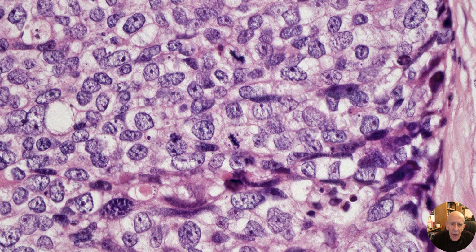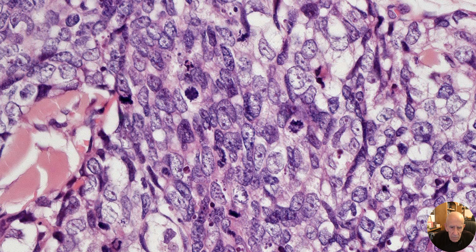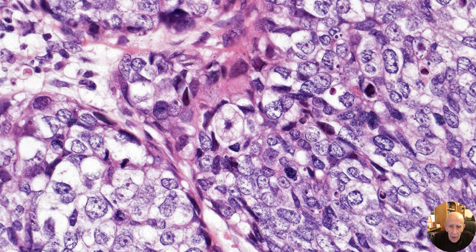And there's a close-up view there showing mitotic activity, nuclear pleomorphism, very marked pleomorphism, prominent eosinophilic nucleoli, and not such well-developed sebocytes in that field. And again, this is another field showing much the same thing with conspicuous mitotic activity and focal apoptosis. And then after due diligence and much searching, there is the perfect sebocyte with a sort of crenulated nucleus and then multiple intracytoplasmic vacuoles. That is the most perfect sebocyte in a sebaceous carcinoma you could ever ask for. So keep that in mind when you're next looking at this sort of tumor.